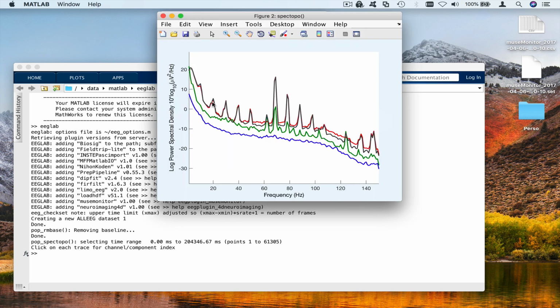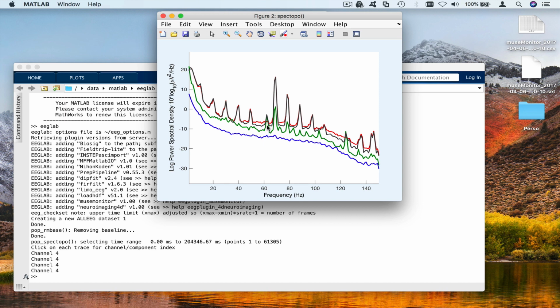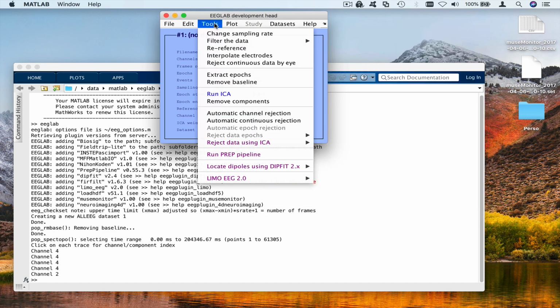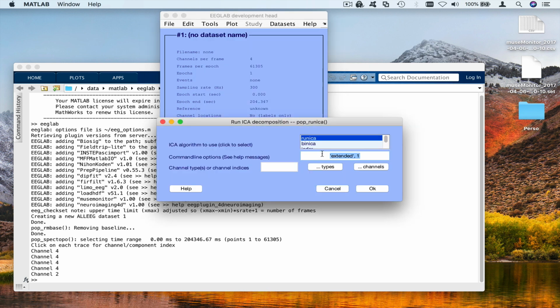And then we can see these are the two channels here, 1 and 4. If we click on them, we get the number. And the green one, which is channel number 2, also has a little bit of artifact. So if we were to process the data without running ICA, we'd probably just reject 1 and 2. But we'll see if ICA can fix that. So I'm going to run ICA. Tools, run ICA. And I'm just going to put the default here.